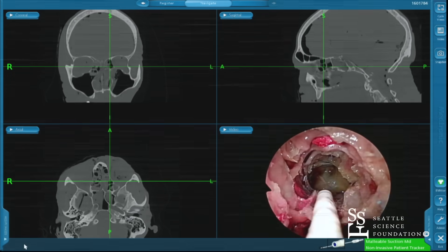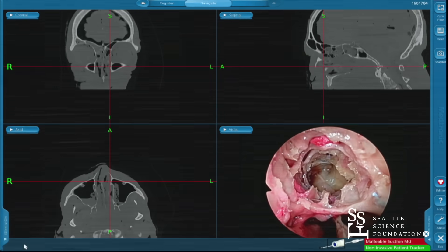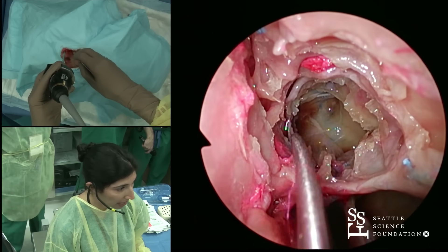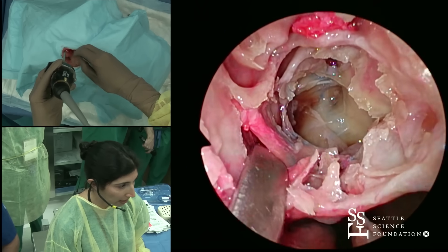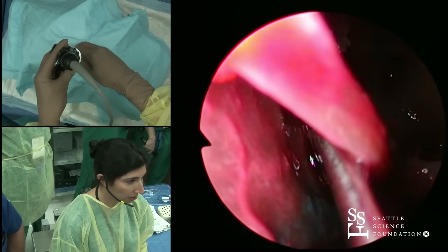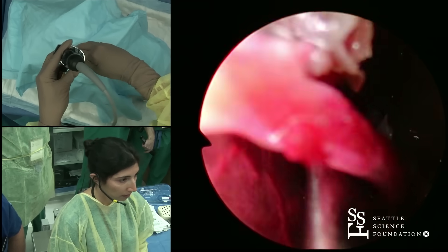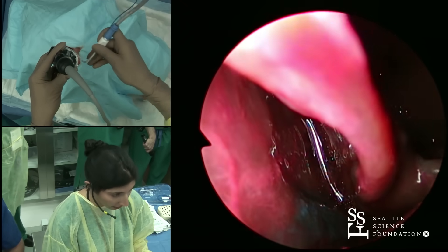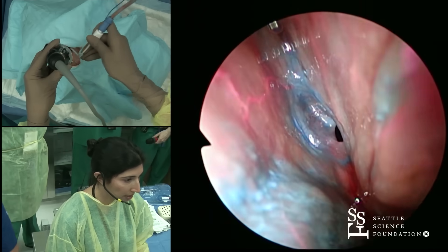After I get out this anterior ethmoid portion and have a really good idea as to where my lamina is and my lateral border of dissection, I'll take a freer. Then I would go ahead and make this same little incision that has already been made here through the basal lamella, and then see my superior turbinate. Just like in that video I showed you, you can sort of move this nicely over. I'm going to suction a little bit so you can see that without all that gunk there.